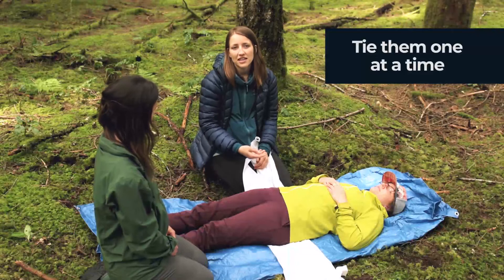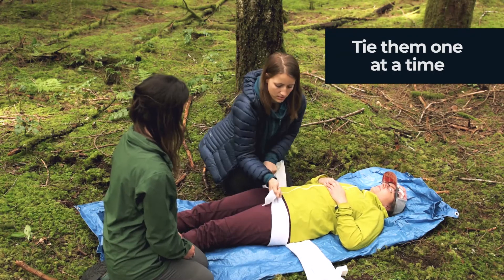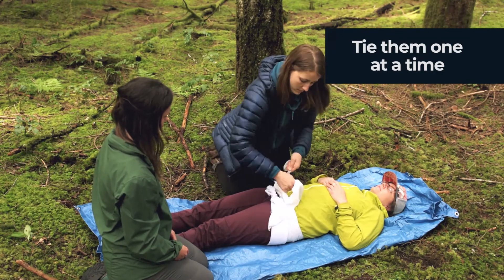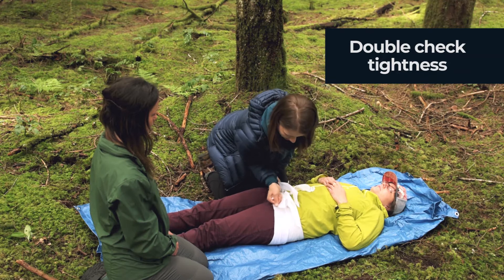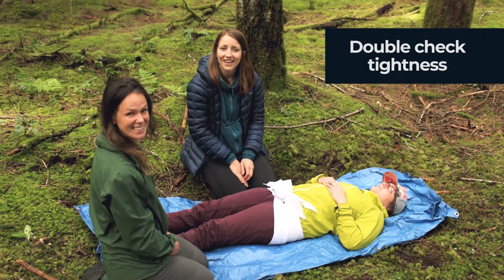Then we're going to take the triangular bandages and tie them one at a time, just snug enough that the patient feels like they're being supported. Tie a bow and make it look nice. Once you've done that, do a double check — you can probably snug up the bottom one a little bit more. And there's your pelvic corset. Use it to reduce pain and bleeding from the pelvic fracture.